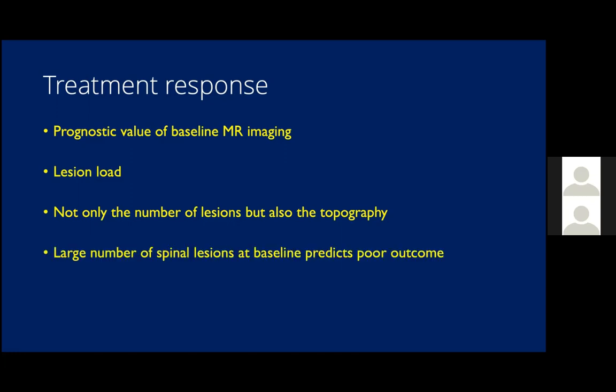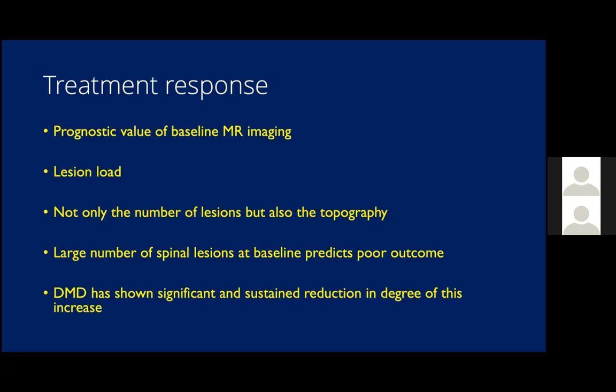So especially it has been shown in literature that a large number of spinal lesions at baseline predicts poor outcome. And the disease-modifying drugs have shown significant and sustained reduction in the degree of this increase in lesion load and lesion size.